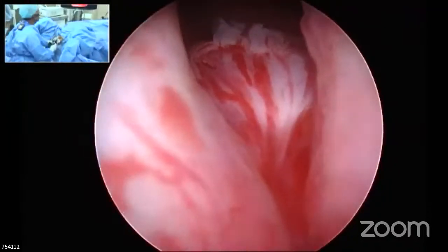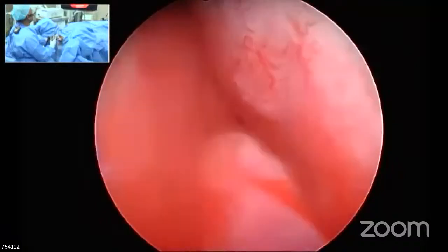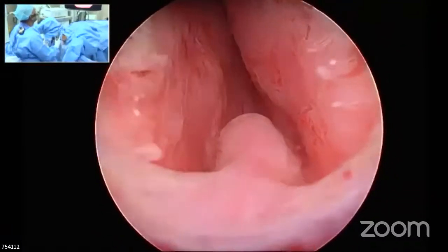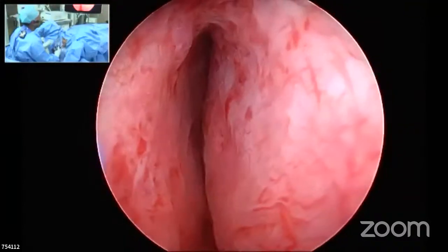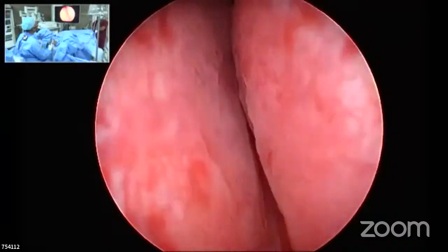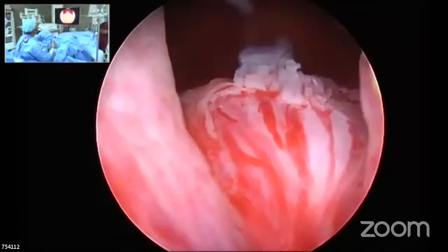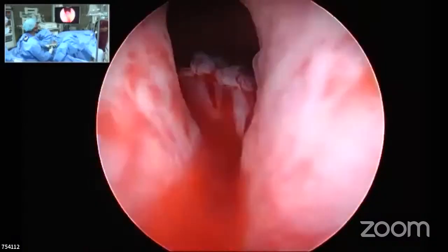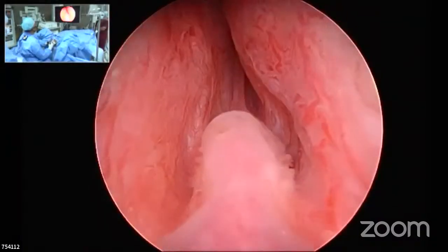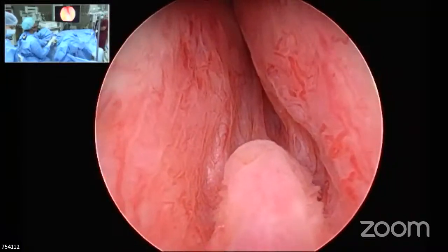Can you focus your Endovision camera? Maybe because of the magnification, it is not so huge. This is a 4K camera, sir. That's the reason why the size will be very large and sometimes looks bigger. Now it's better. Okay, sir. Yeah, I focused it.